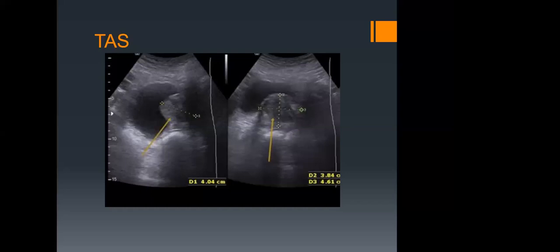You have prostatitis. It's going to give you pain. But when you do transabdominal, most times you will have a normal scan. But when you do transrectal, it is easy to pick out the signs. We shall see what prostatitis looks like. So this is how your normal transabdominal images will appear.